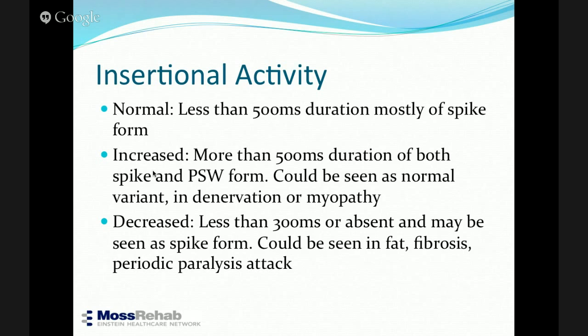If it is less than 300 milliseconds or absent, it is decreased. When you are not in the muscle, it's going to be decreased. If you are in fat or a fibrotic muscle, or when there is periodic paralysis or potassium depletion, you're going to have decreased insertional activity.